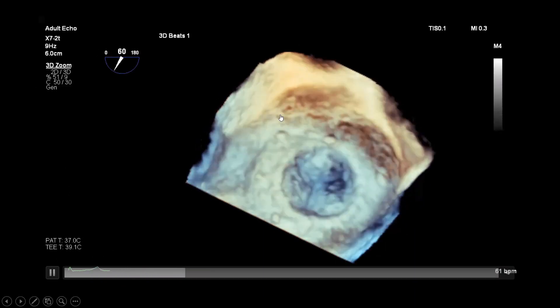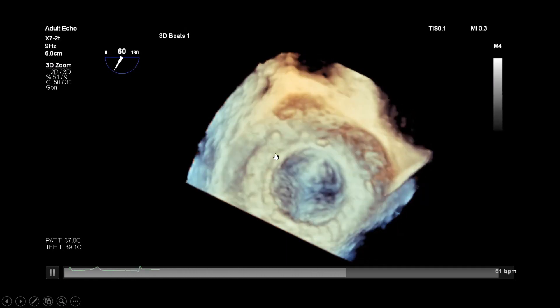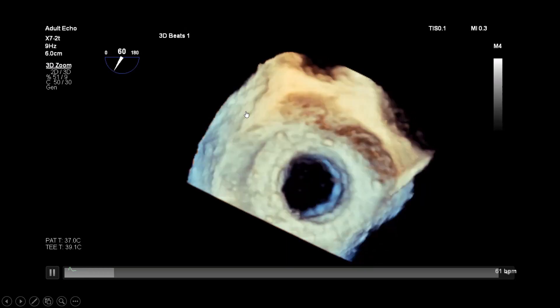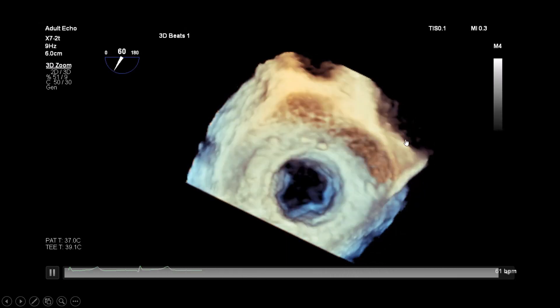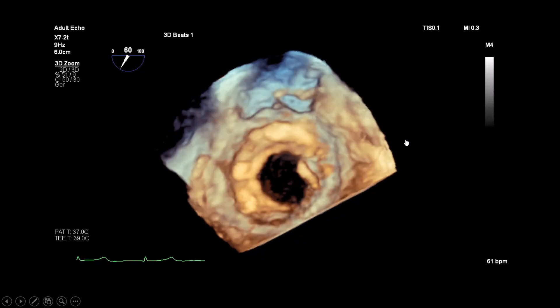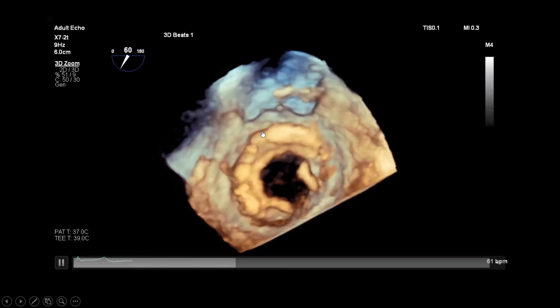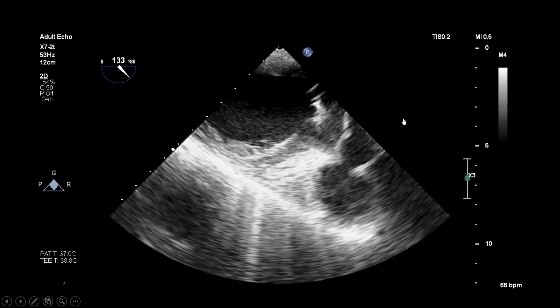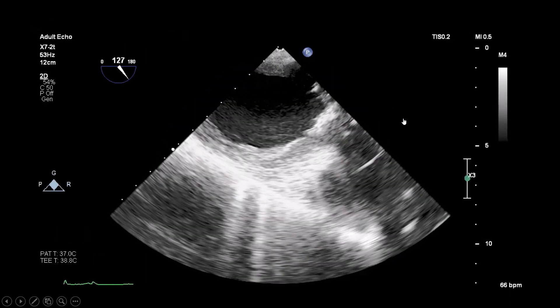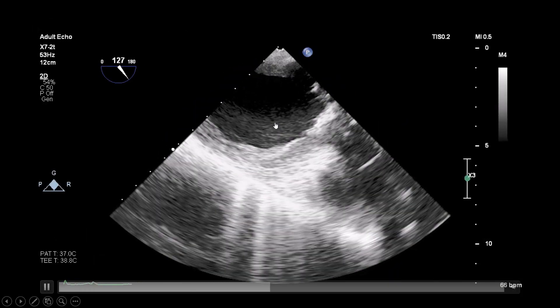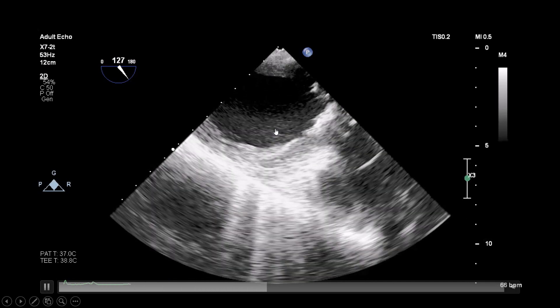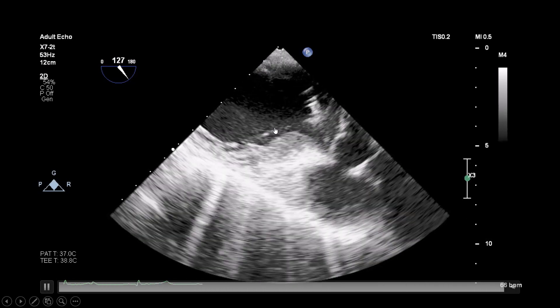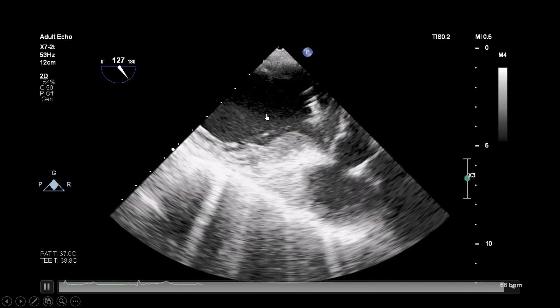This is the 3D TEE of the newly implanted mitral valve. You can see the three cusps are now opening very nicely. From the left ventricular aspect, you can again confirm the patient has no stenotic mitral valve at all.